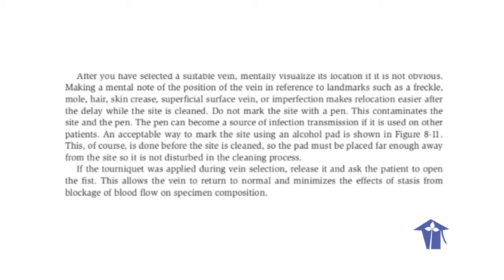Do not mark the site with a pen. This contaminates the site and the pen. The pen can become a source of infection transmission if it is used on other patients. An acceptable way to mark the site is using an alcohol pad. This, of course, is done before the site is cleaned, so the pad must be placed far enough away from the site so it is not disturbed in the cleaning process.